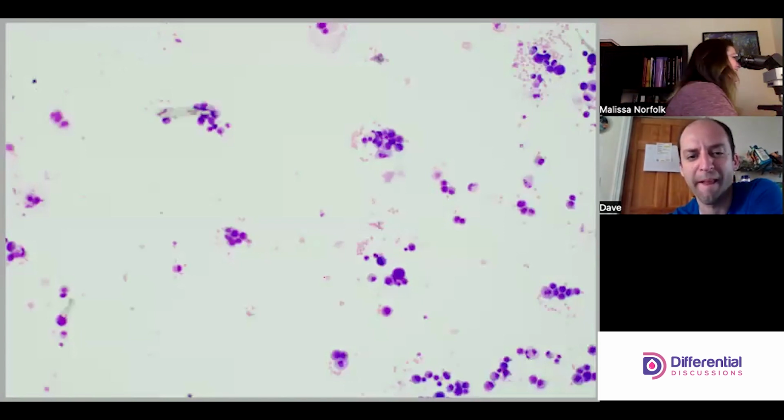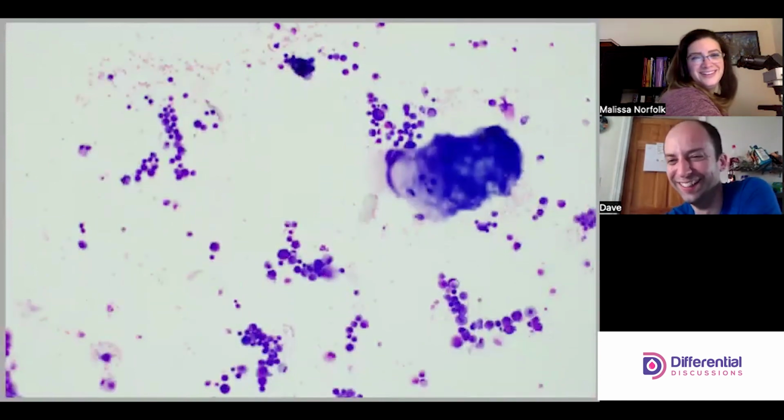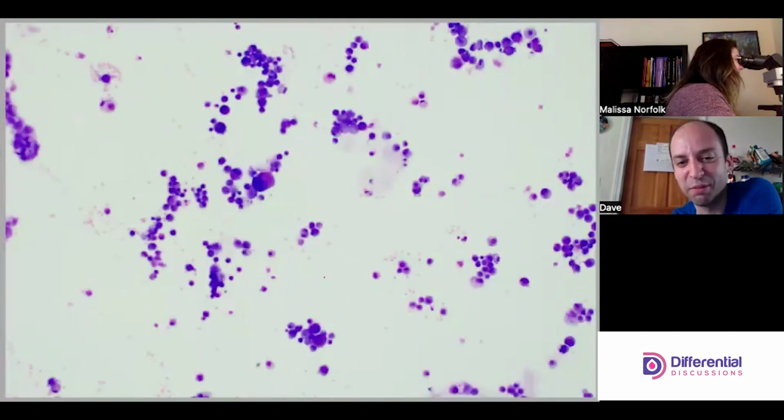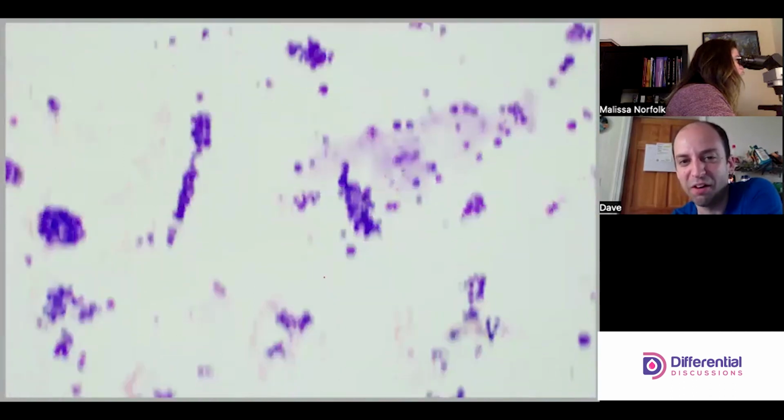So that's a thing. What is that? Oh my goodness. All right, we're gonna keep scanning and be disciplined, but wow.